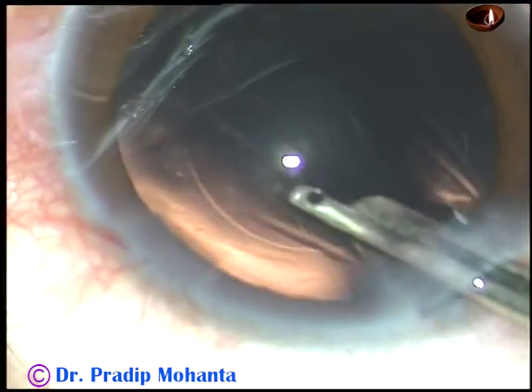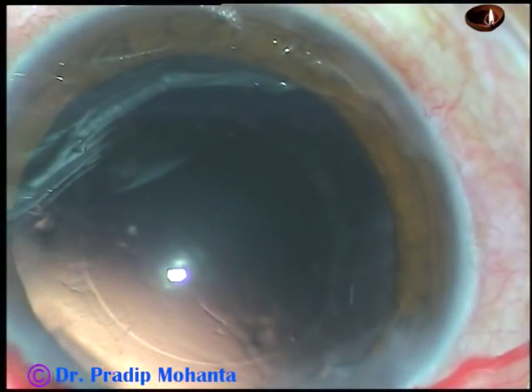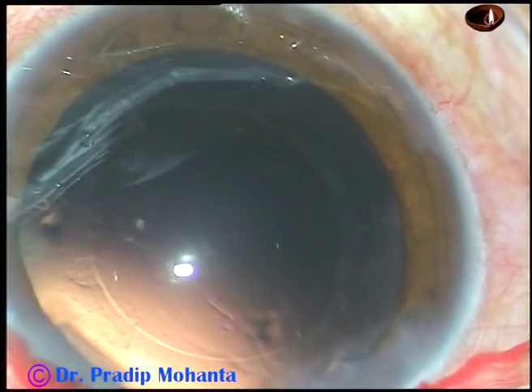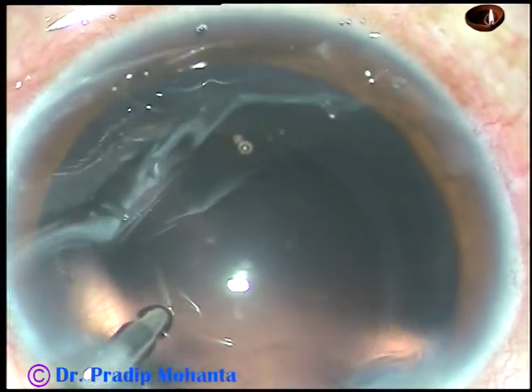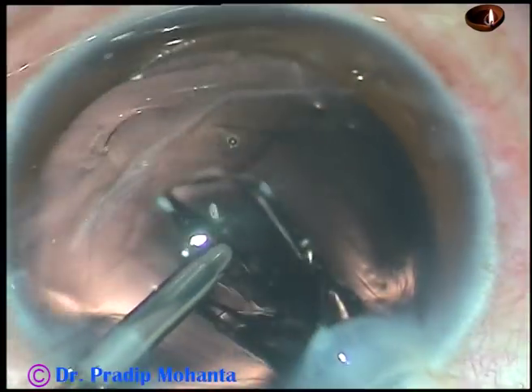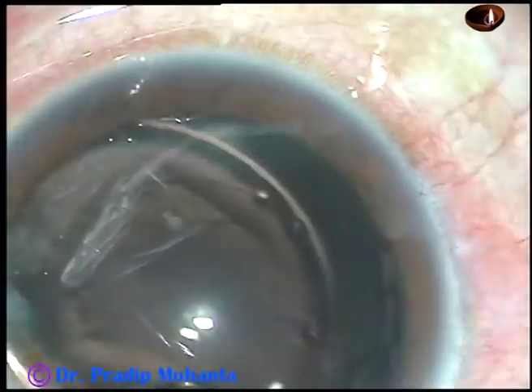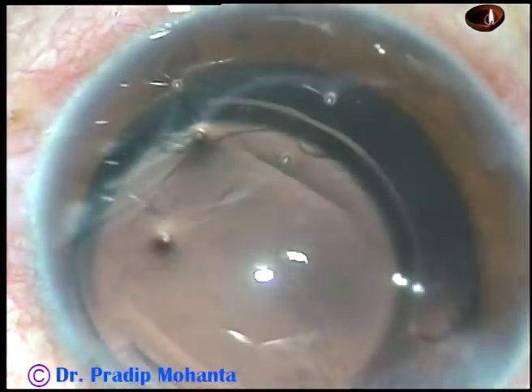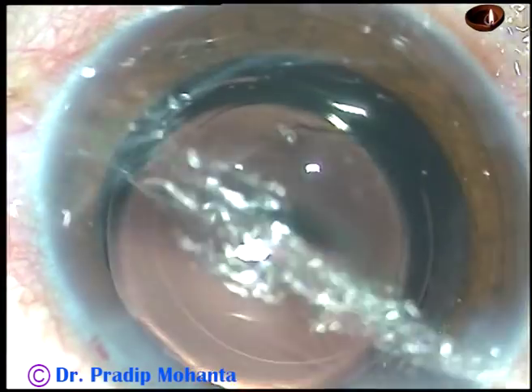The posterior capsule is clean. Now a foldable intraocular lens is being implanted, keeping the anterior chamber formed by irrigating BSS. The leading haptic goes into the capsular bag, and the trailing haptic also goes into the capsular bag by a gentle push of the irrigating probe.